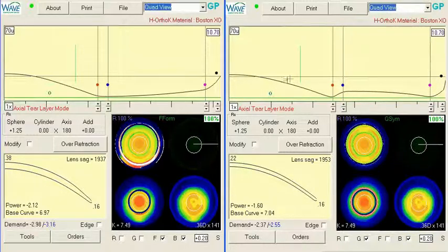With an optic zone that's too large, sometimes what we see is we get molding, except at the apex where we have the most clearance. And if that's the case, then I would decrease the OZ again, but I didn't really see that in the posterior topographies. So I would lift until about halfway to the 20 micron, and then also increase the demand on this side to at least a 2.1.